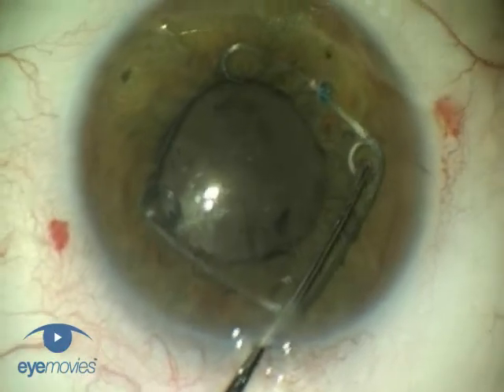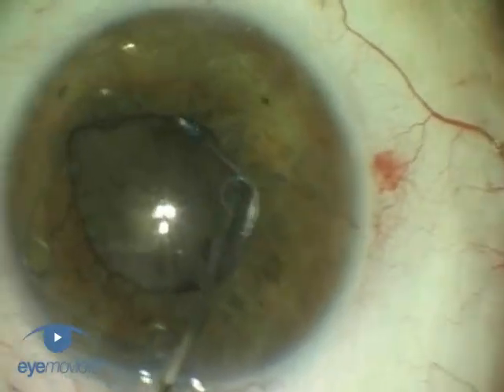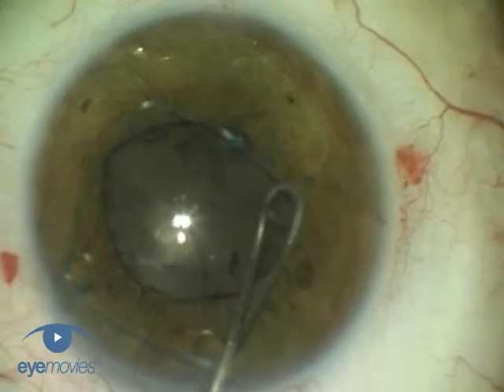Each loop is engaged by compressing the ring, dropping it down over the edge of the iris, and then releasing and sliding it over the pupil margin.